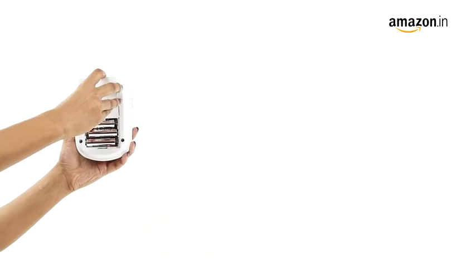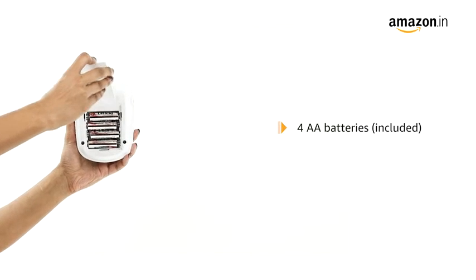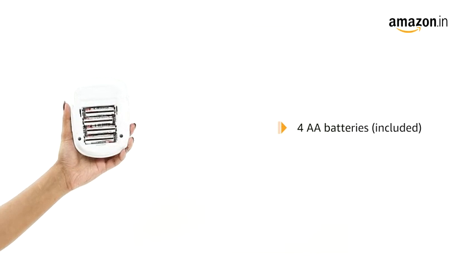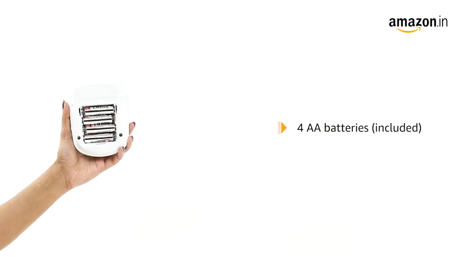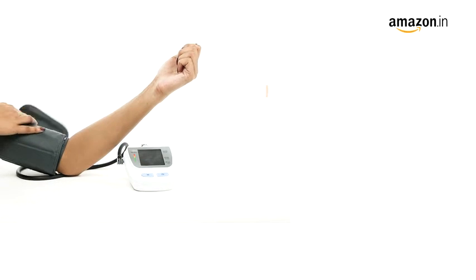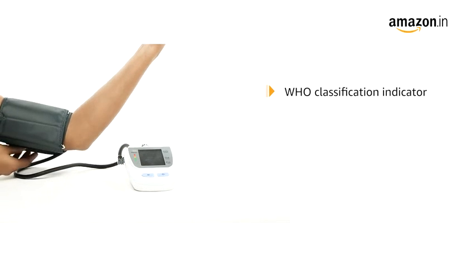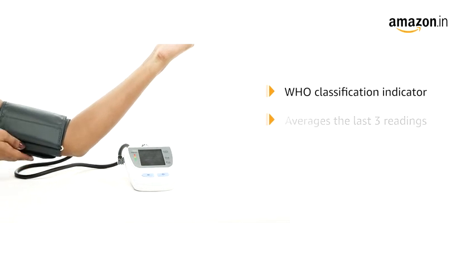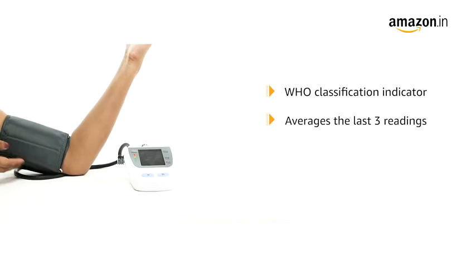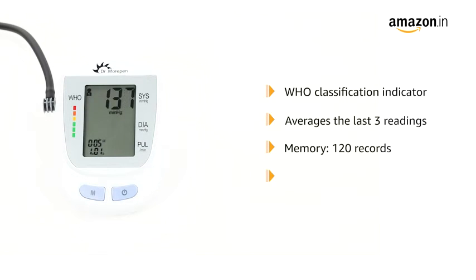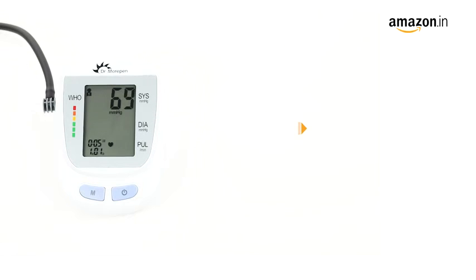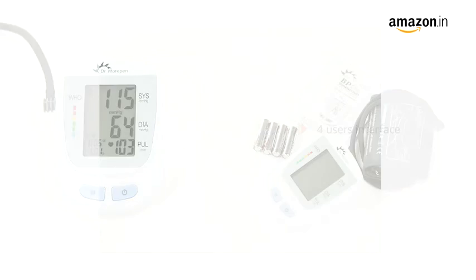To function, it requires four AA batteries which are also included in the box. The BP monitor features a WHO classification indicator, average of the last three readings, a 120 records memory and irregular heartbeat detection. It also has a four-users interface.